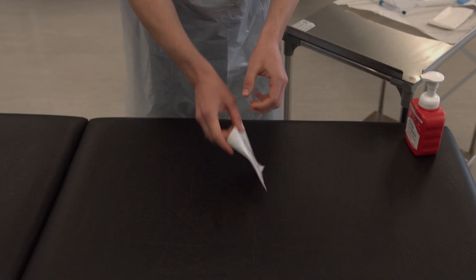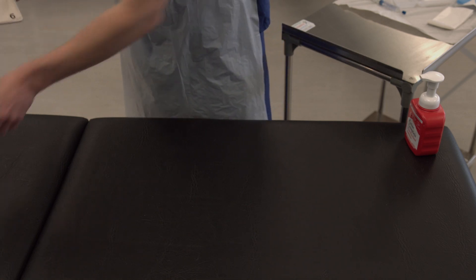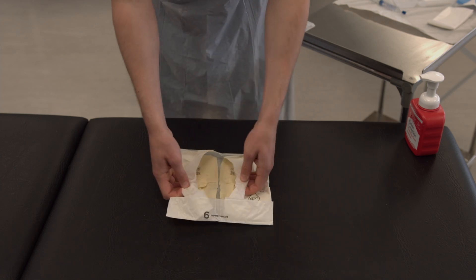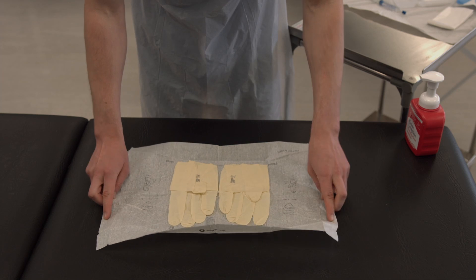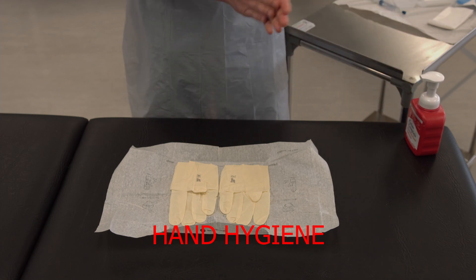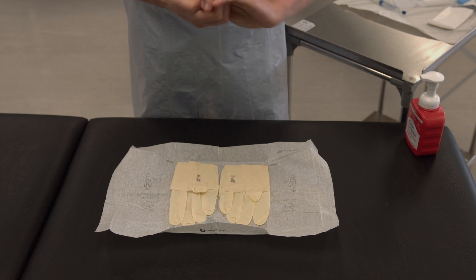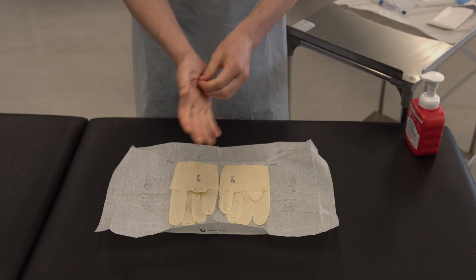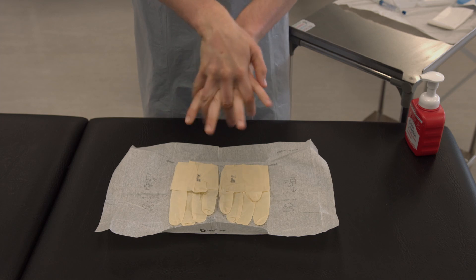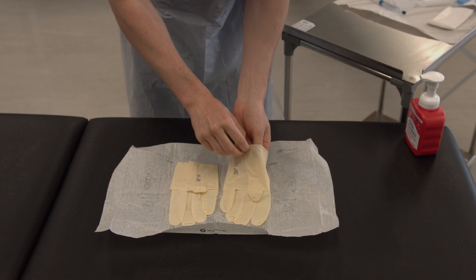Then open the package for your second pair of sterile gloves. Get them ready to put on and wash your hands using the seven steps of hand hygiene. Then put on your gloves using a sterile technique.